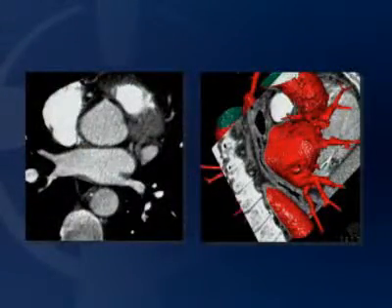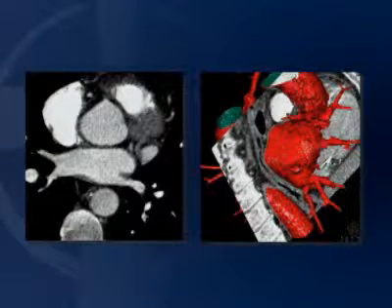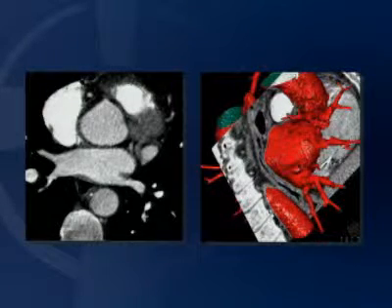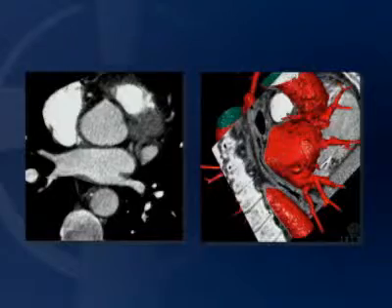All right, let's take a look at the slides. The viewer earlier had a question about the esophagus. What we're looking at here on the left is a CT scan of the heart. This is the left atrium, and this area here is the esophagus. It also runs all the way down here. You can see the esophagus is in very close proximity to the left atrium. We're aware of that, and we do everything we can to protect it from injury.